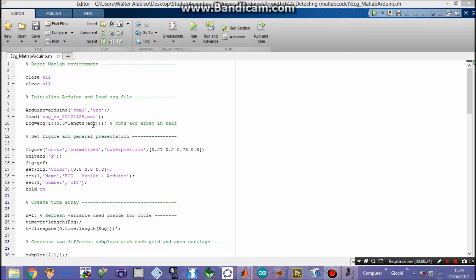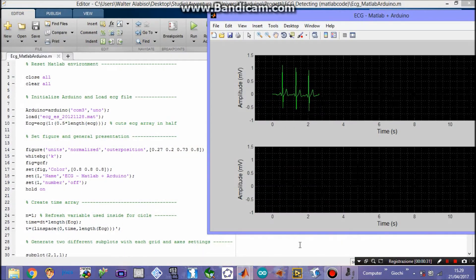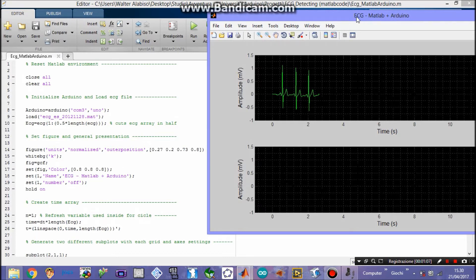This next operation will cut the ECG in half in order to create two different subplots. Here you have a truncated figure for the sake of precision. Then we set the figure itself and general presentation, decide its outer position. If you want a full screen figure at the beginning, you have to insert 0011 in this instruction. Then we decide the background for each graphic, which will be black, and the color which is gray, thanks to this vector, and the name 'ECG MATLAB plus Arduino' as you can see here.